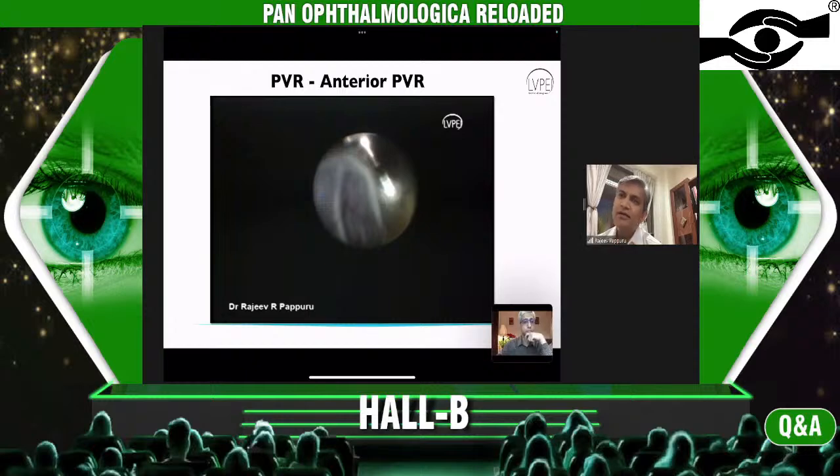And then ultimately, you might end up attaching the retina by cutting the retina in the periphery, but you will not be able to salvage much in this because of the hypotonia, which sets in and continues for a long time. So that's important to identify the anterior PVR. So that's the second pearl, I would say, that identifying this and removing it to the extent possible is important.